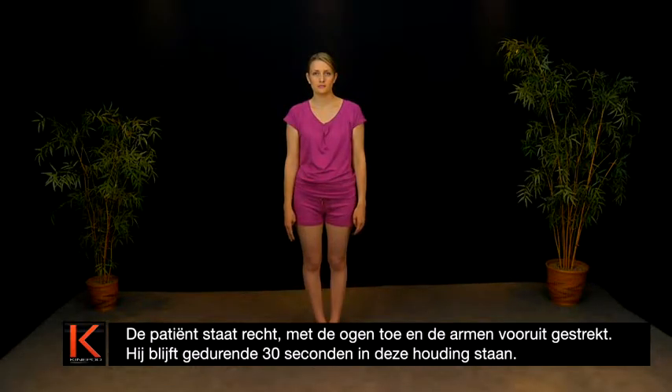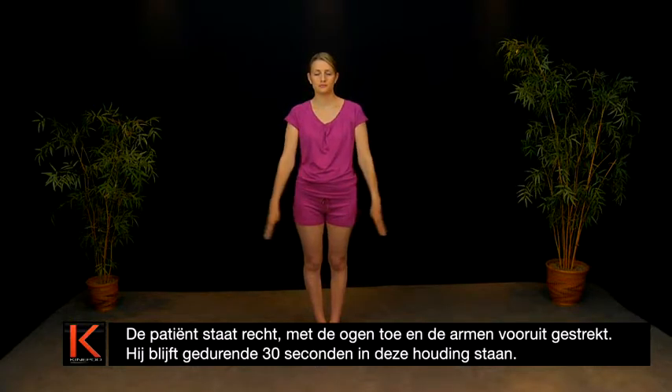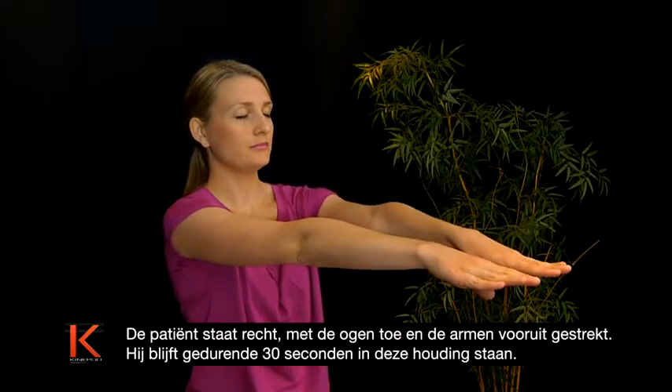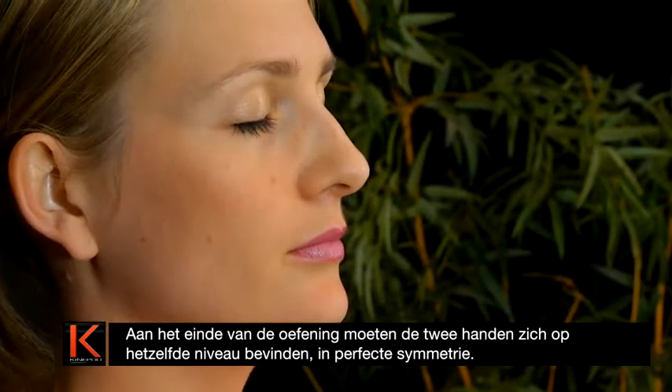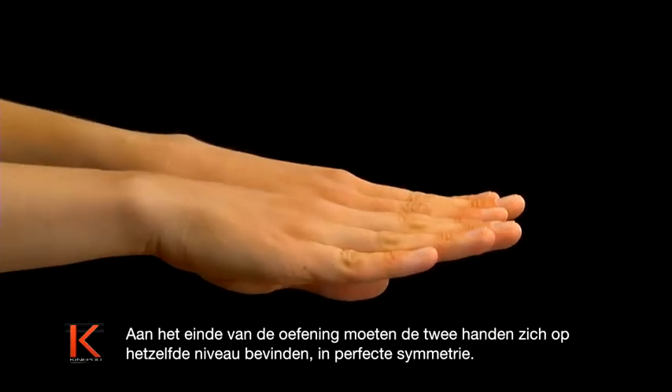The patient is standing, eyes closed and arms outstretched. He stays in this position for 30 seconds. At the end of the exercise, both hands should end up at the same level, in perfect symmetry.